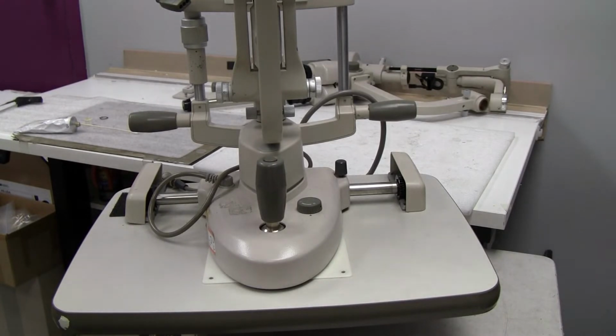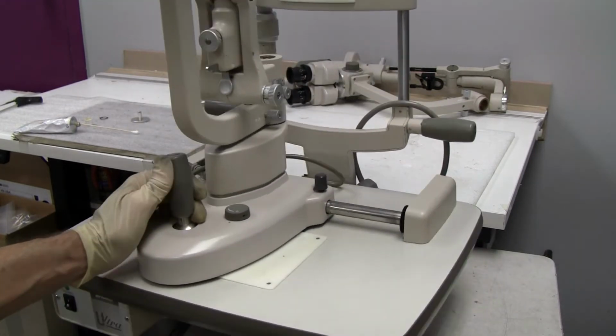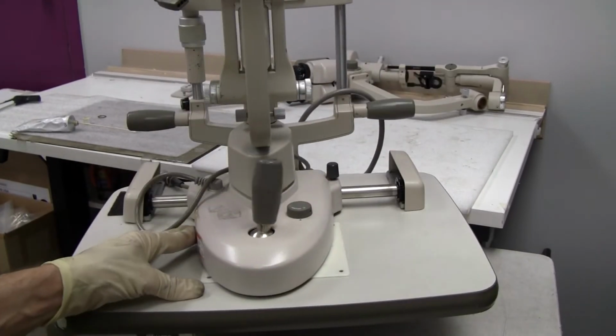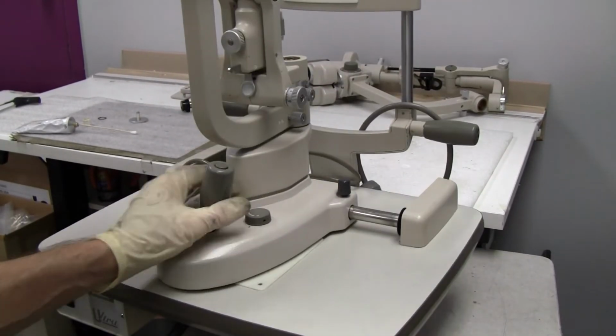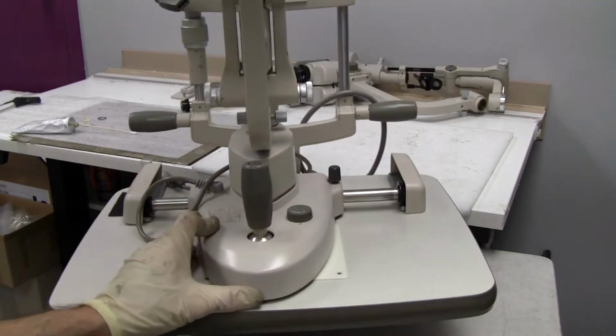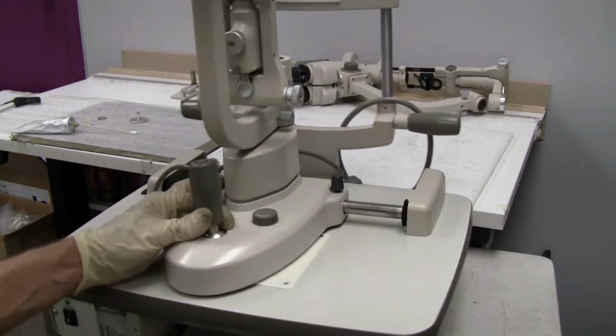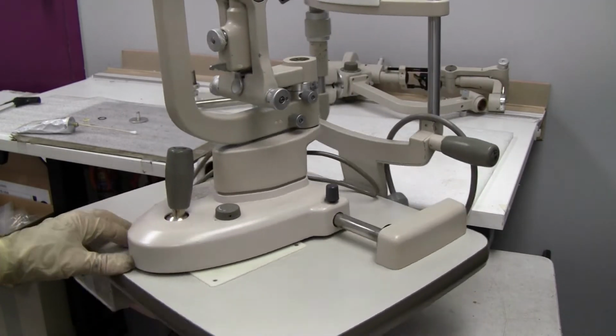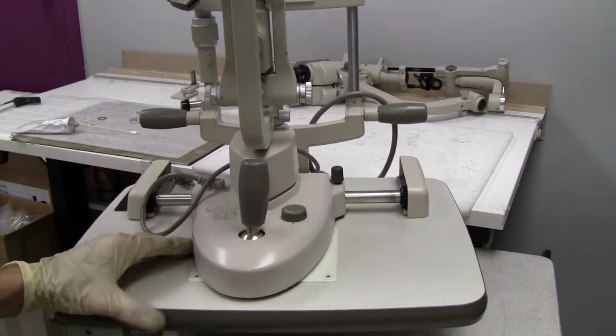Ultra slit lamps, that would be G2, G4, G5 Ultra. The bases are similar in those three types, but there's some issues here that I'm just going to run through to remind myself and to let you in on some things about them.